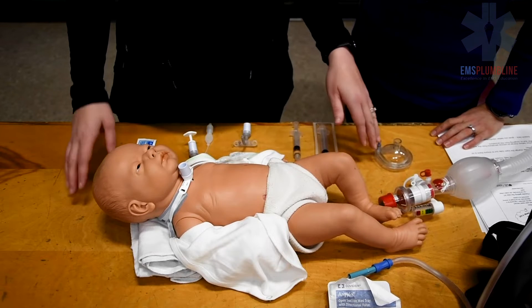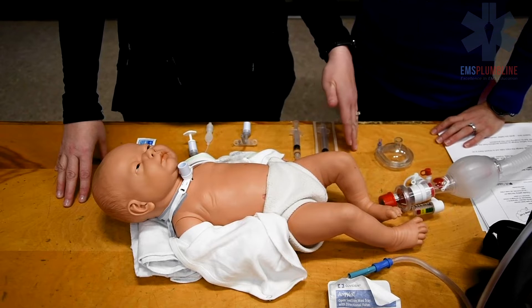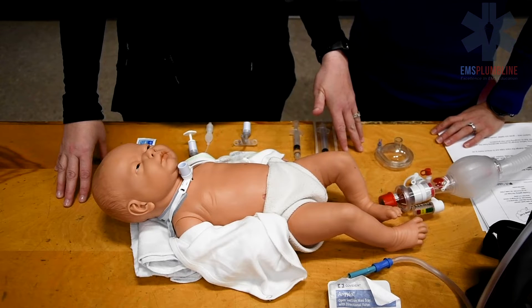Now let's do a trach change. Consider changing the trach tube with any trouble performing suctioning or oxygen desaturation that does not improve with suctioning.